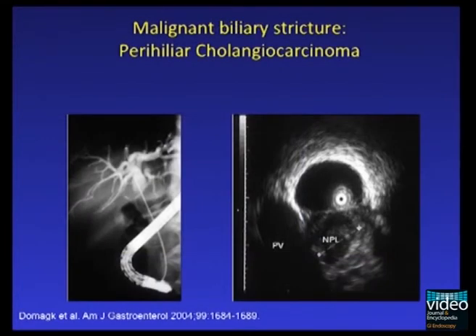Another important indication is the evaluation of proximal stenosis. ERCP shows a complete obstruction of the common bile duct with dilation proximal to the stricture. IDUS of the same patient demonstrates a hypoechoic, inhomogeneous lesion suggestive of a malignant neoplasia infiltrating the portal vein.